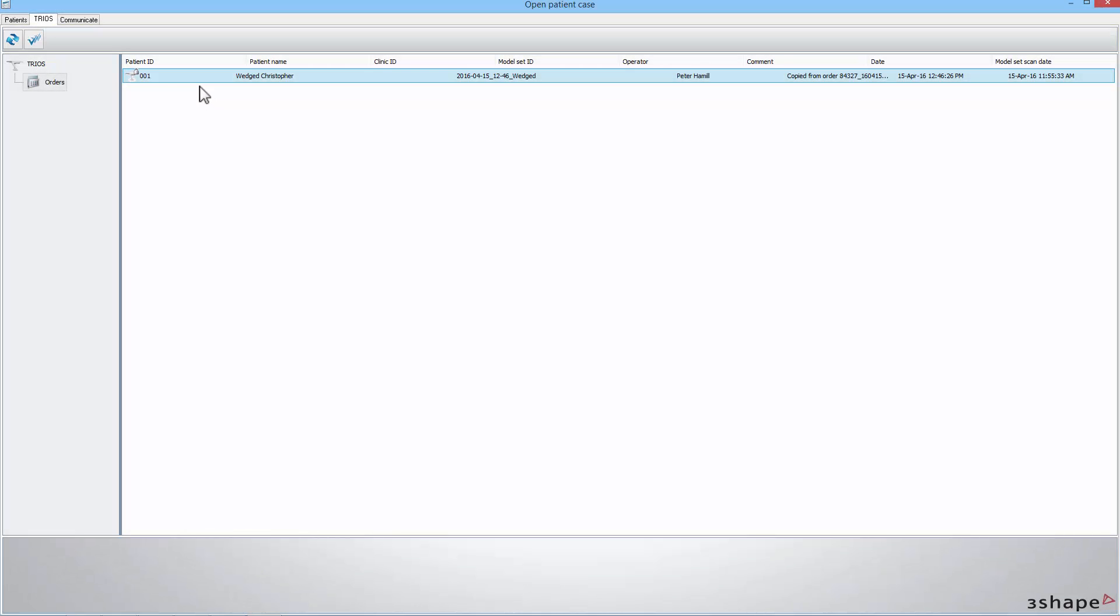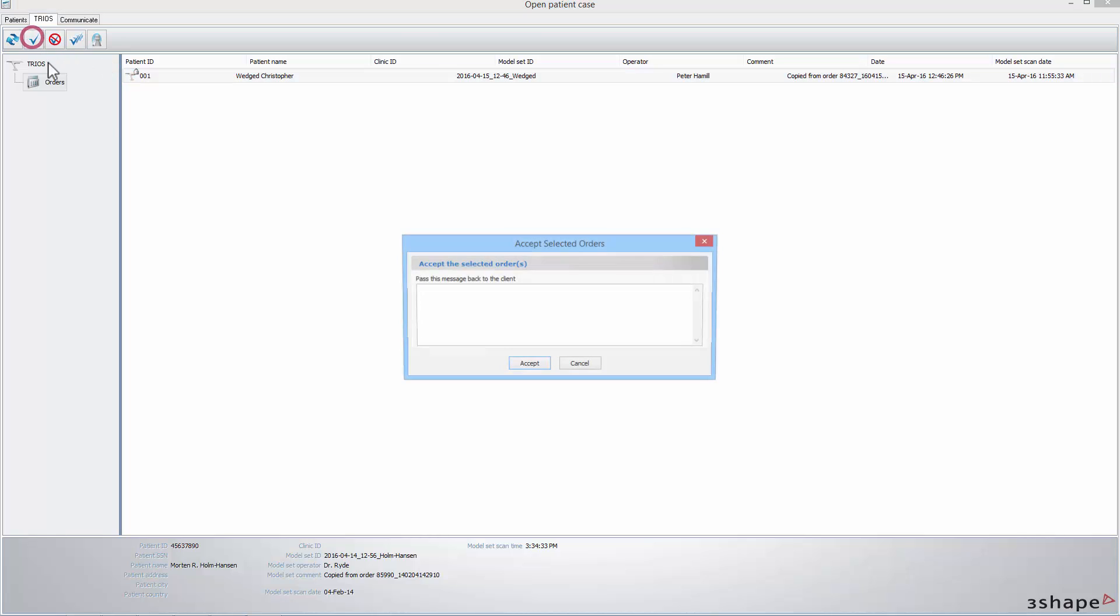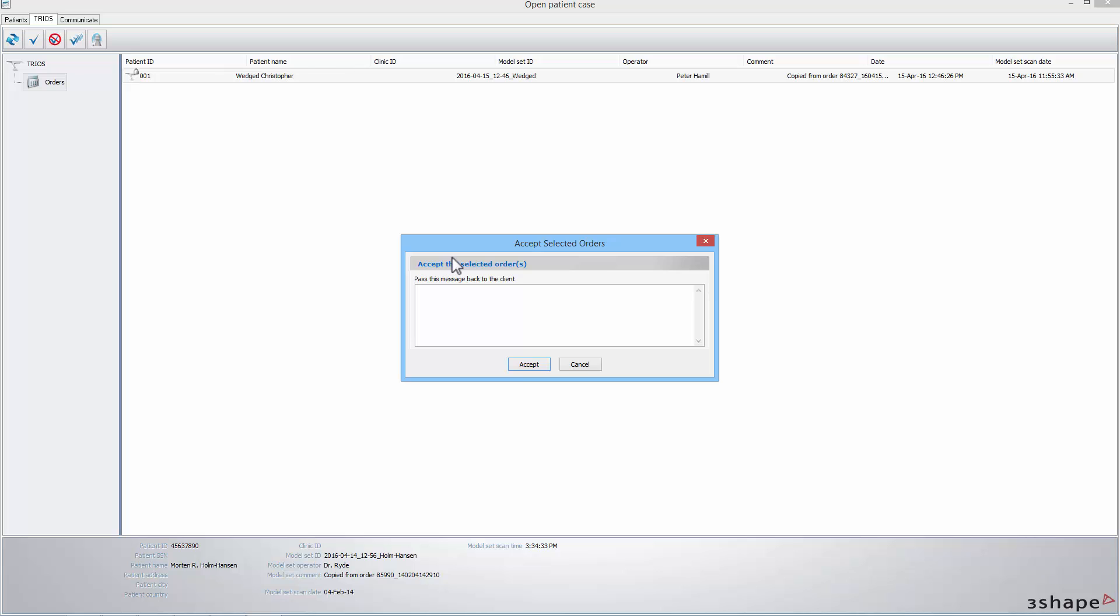To accept an order, click on it to select it, and then accept by clicking on the corresponding button in the bar in the upper left corner. In the pop-up window, click the Accept button.